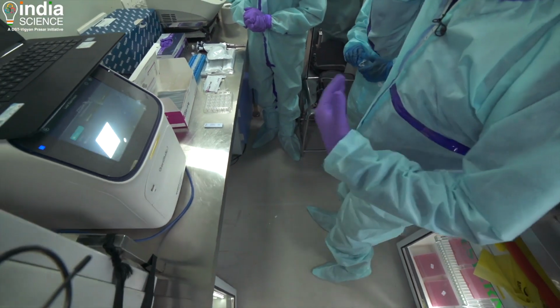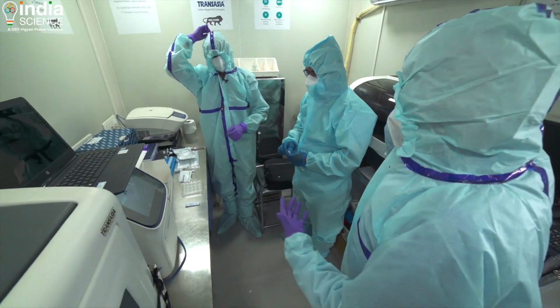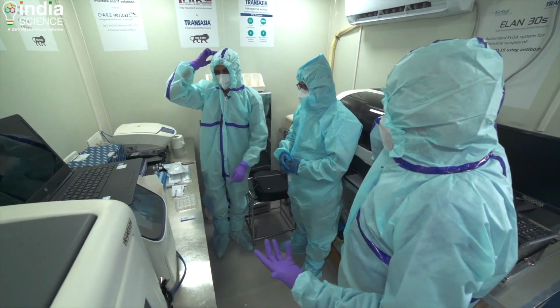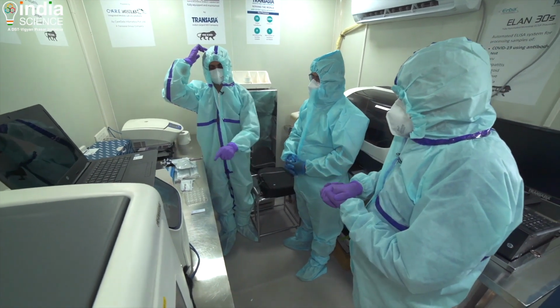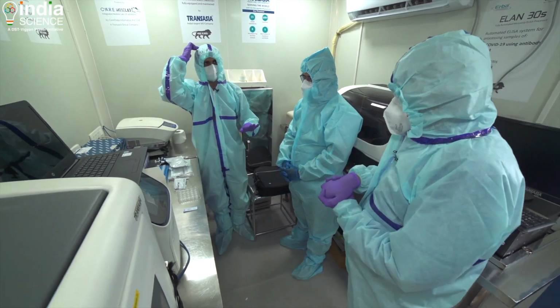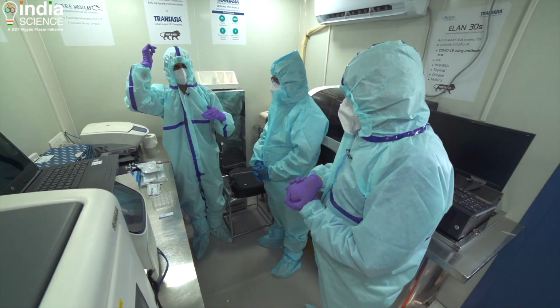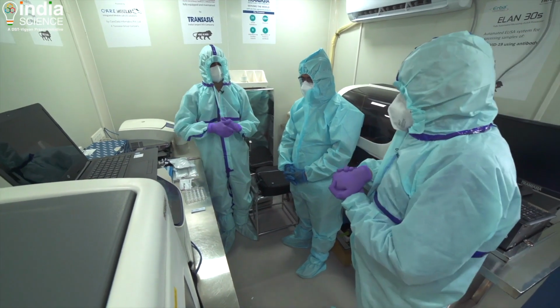So we can safely say this one is negative. And if somebody is negative on antigen and has symptoms, then one has to run an RT-PCR, because the sensitivity of this kit is a little lower than RT-PCR. If it is positive, clearly they are positive. They don't need to be repeated again on RT-PCR. If it is negative, you still would like to confirm by RT-PCR because that's much more sensitive than this.